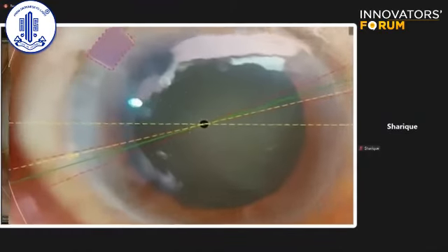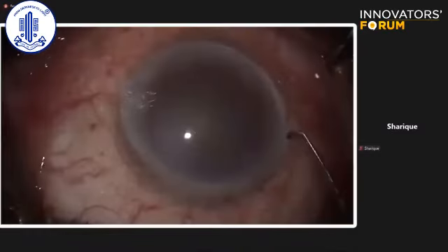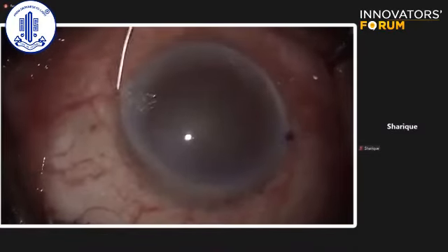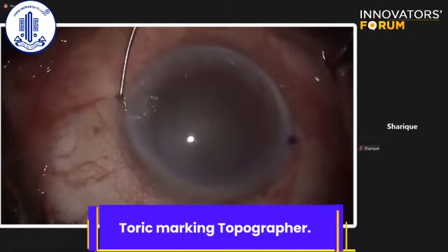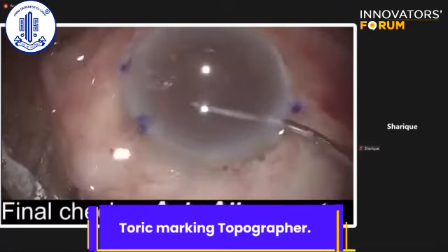It eliminates parallax errors as the iris is very close to the lens marks. You can also mark landmark points during the initial stages of surgery, which can be used for axis alignment or to double check the axis of alignment using a degree gauge.